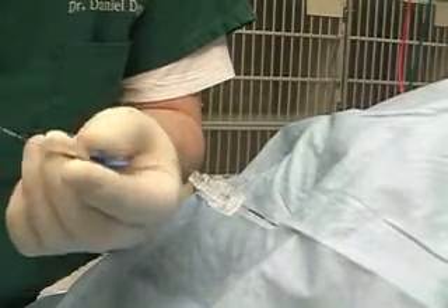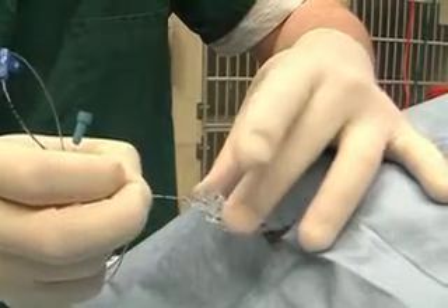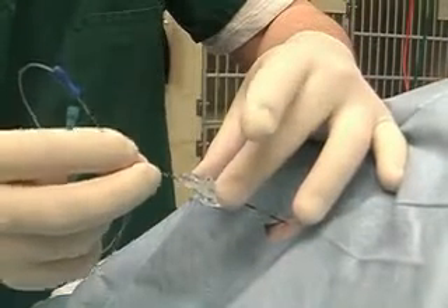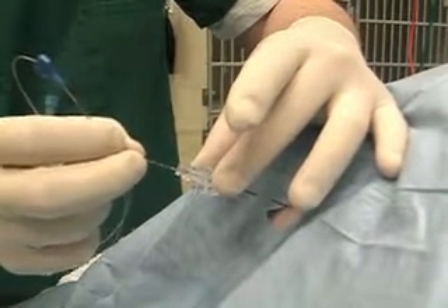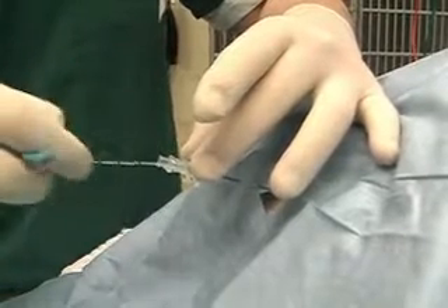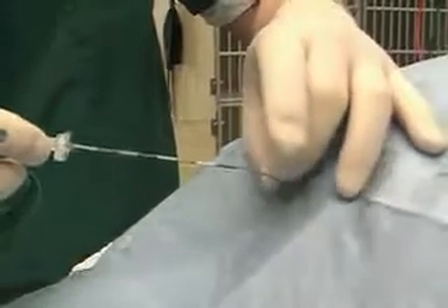We've aspirated down into the epidural space. We're going to now insert the catheter — it should go fairly easily, but I'm getting resistance though. I'm going to leave it about there.